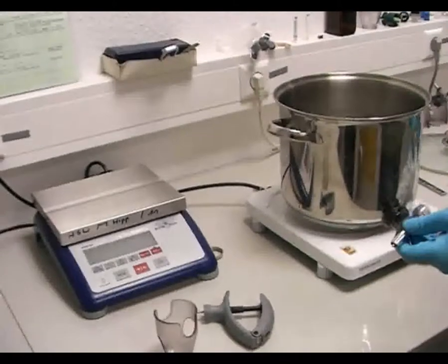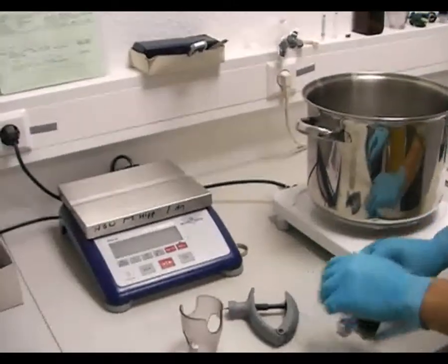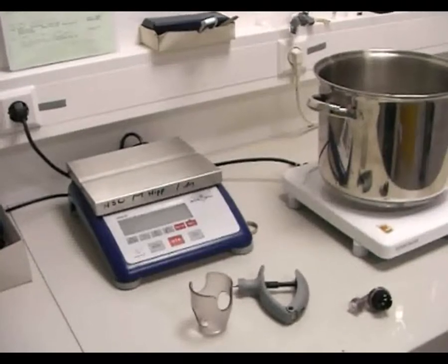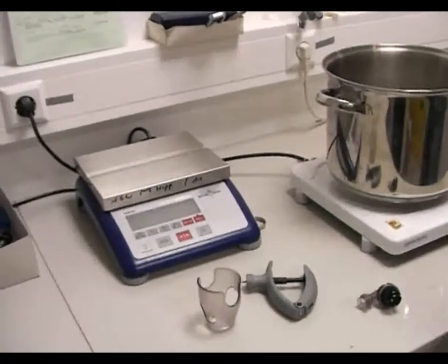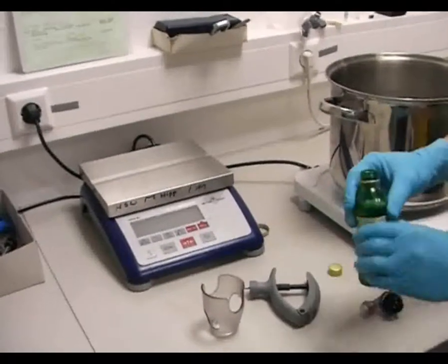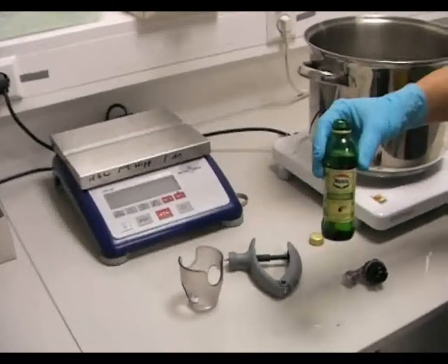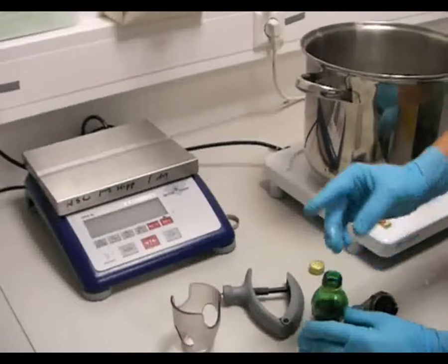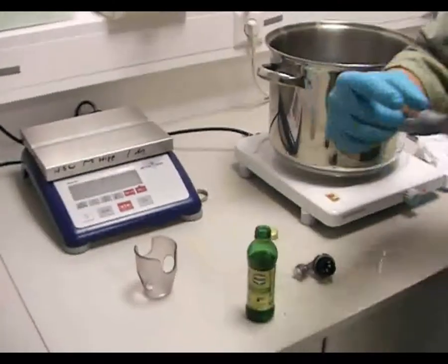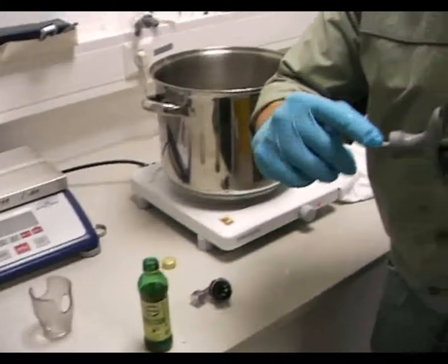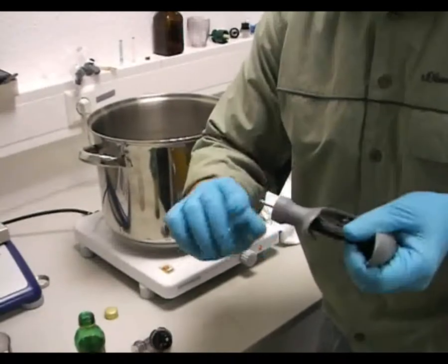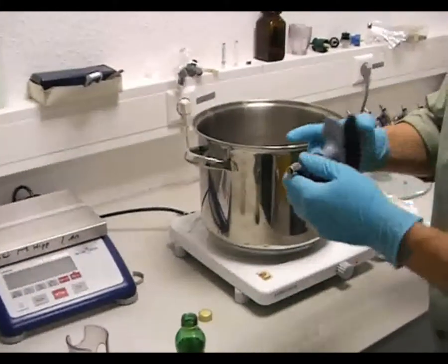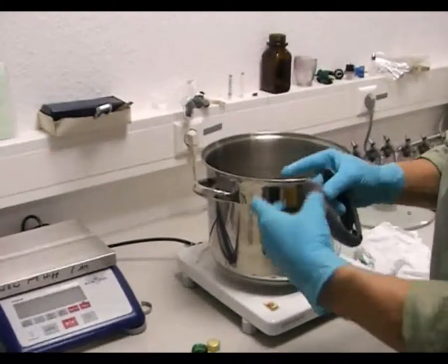Nun empfehlen wir den O-Ring auf der Kolbenstange mittels Wattestäbchen oder Q-Tip mit kaltgepresstem, hundertprozentigem Olivenöl oder ähnlichem leicht einzureiben, um ein leichtes Laufen nach der nächsten Anwendung zu ermöglichen. Weitere Teile müssen nicht eingeschmiert oder gefettet werden.